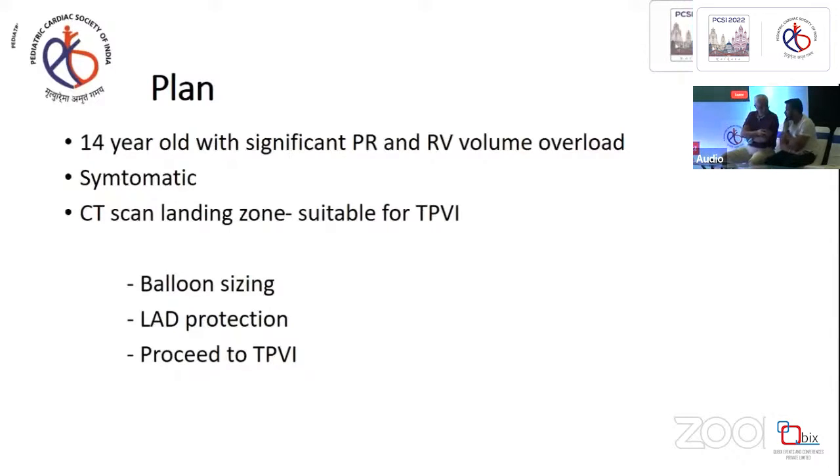My question to you is, why don't you pre-stent? There's no need actually, Bharat. Number one, I'm telling you the difficulty we have with pre-stenting. If you want to pre-stent, you have to use a 28 balloon. A 28 balloon means you have to use a big sheath, around a 14 or 16 French sheath. A stent over that, you have to have 22 French to take across. And we always have difficulty getting a sheath which is more than 18 French in India, but that's not the problem. I'm just thinking, if we can do it without pre-stenting, then why should we pre-stent?